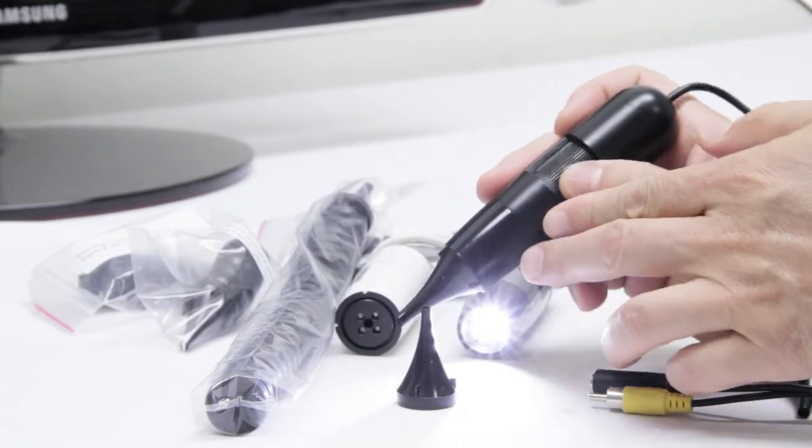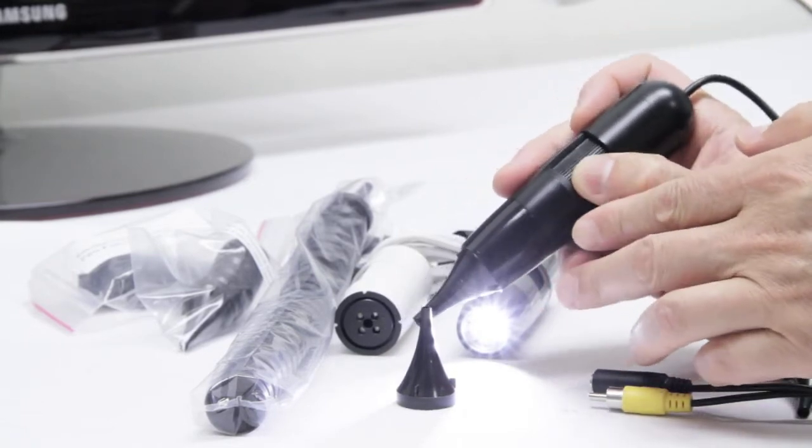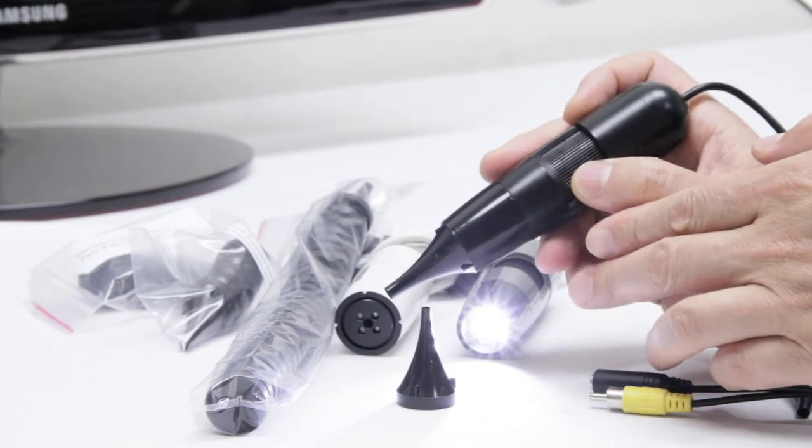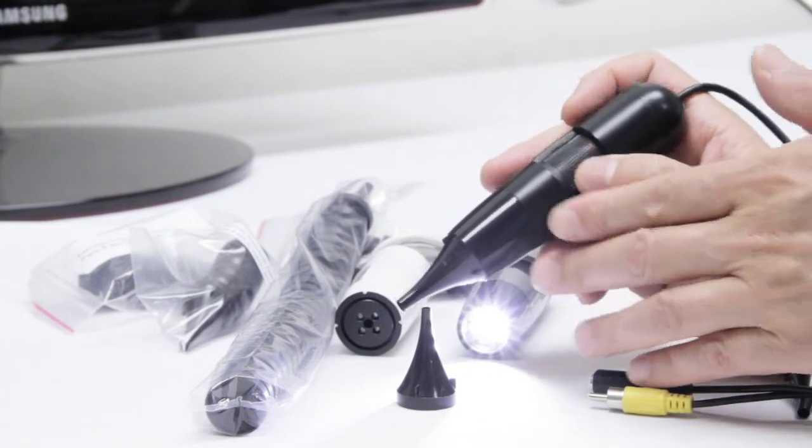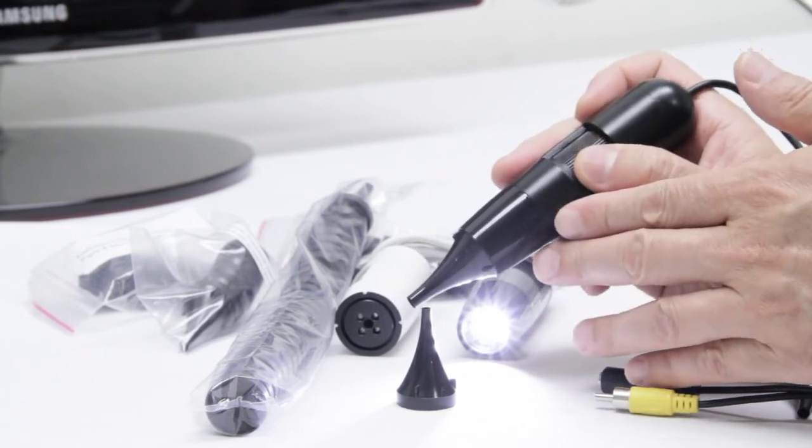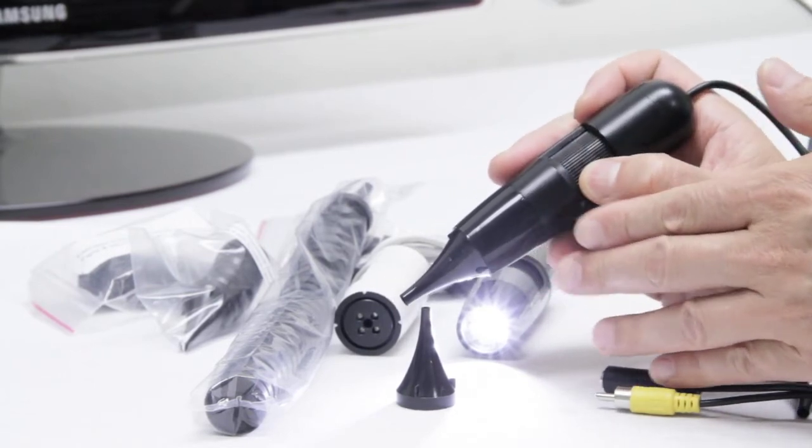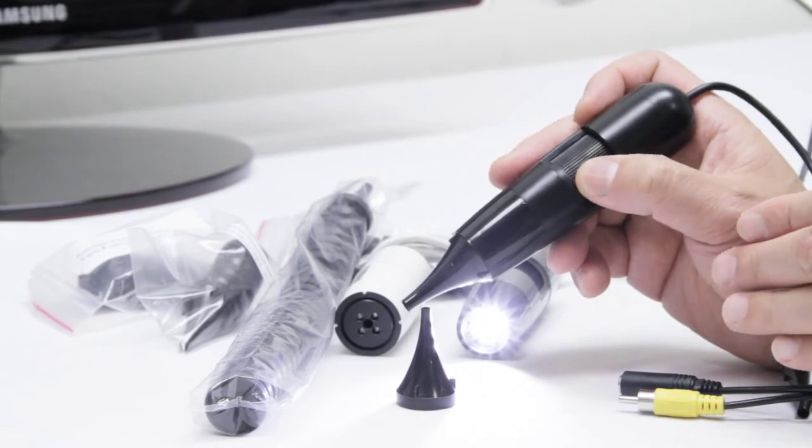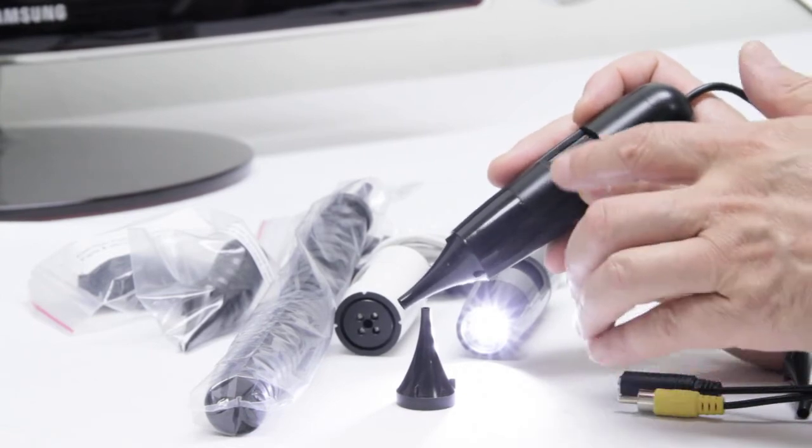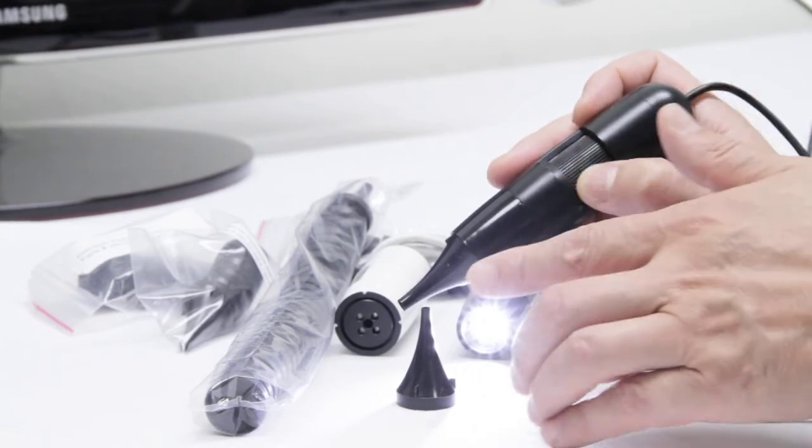When examining inside of the ear canal, you can expect to maintain a 20 times magnification. You can also change that to 10 times the magnification using the rotary dial on the side of the unit.